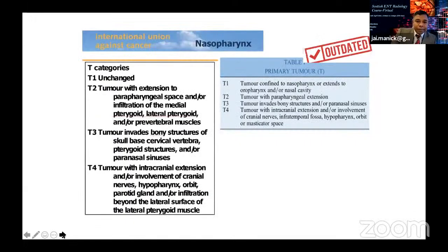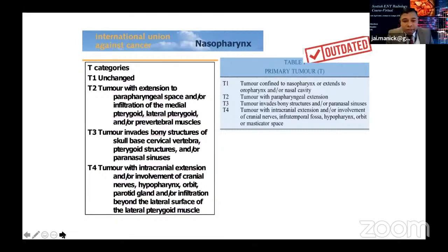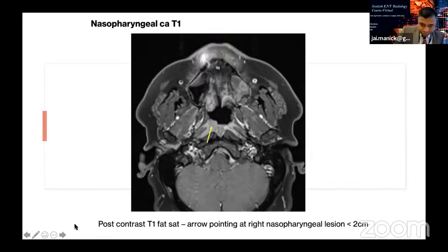Right. So coming to the nasopharynx staging, the staging scans are very important. Particularly, there is a recent change in the classification because the tumor size is different, and nodal size is different. 6 centimeters is a benchmark, and also the cricoid cartilage is the line of division.